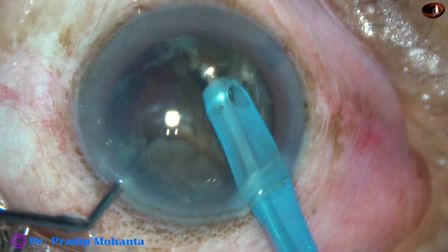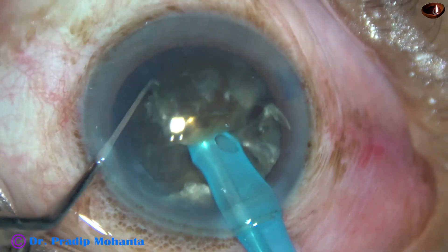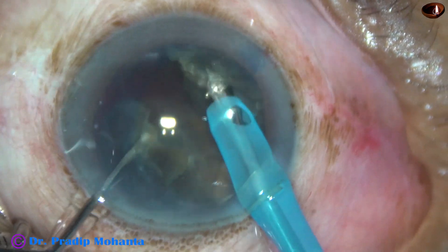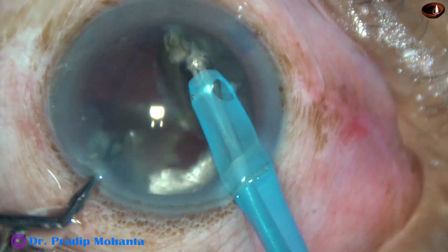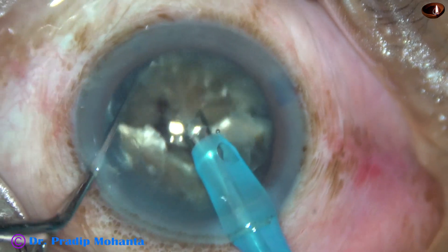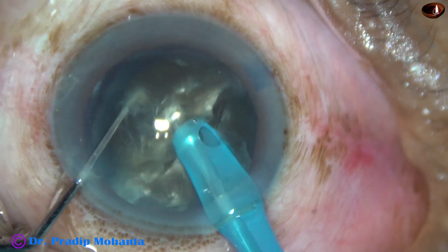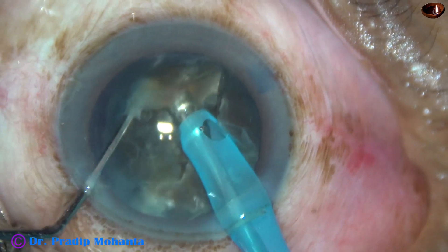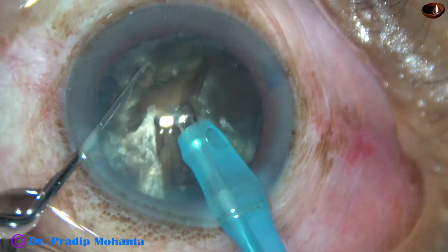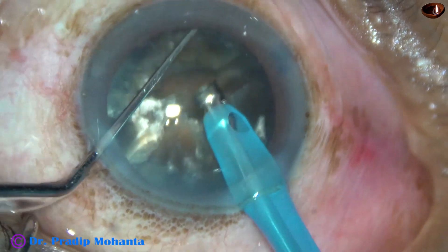This is one piece, and this larger piece is again divided, so we get three separate pieces from the larger heminucleus. The other heminucleus is divided into two pieces, giving us five pieces total. Now we are going to emulsify these nuclear pieces.